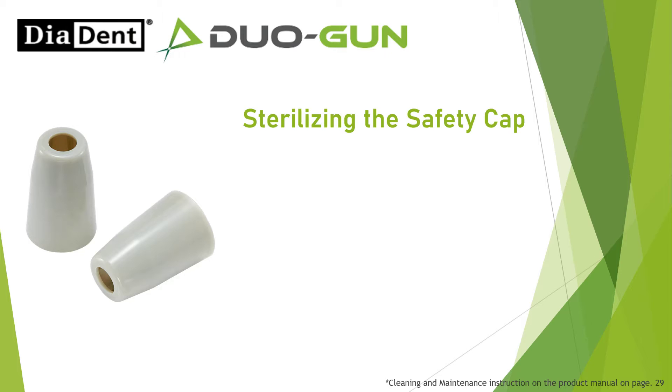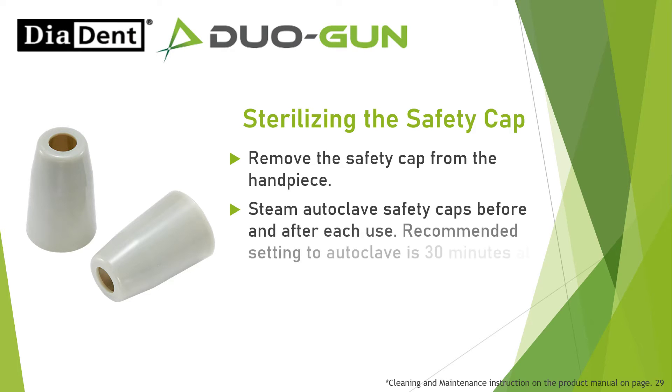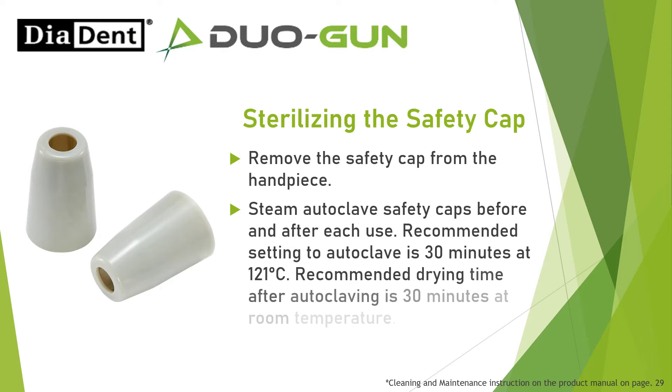Sterilizing the safety cap: Remove the safety cap from the handpiece. Steam autoclave safety caps before and after each use. Recommended setting to autoclave is 30 minutes at 121 degrees Celsius. Recommended drying time after autoclaving is 30 minutes at room temperature.